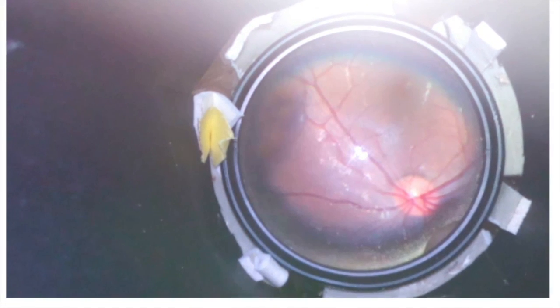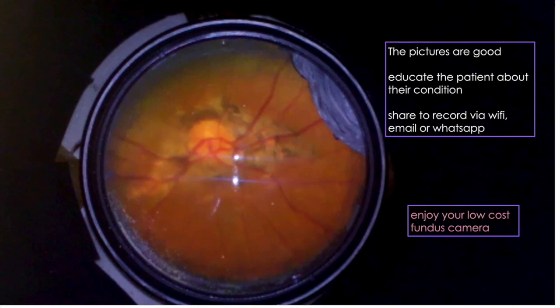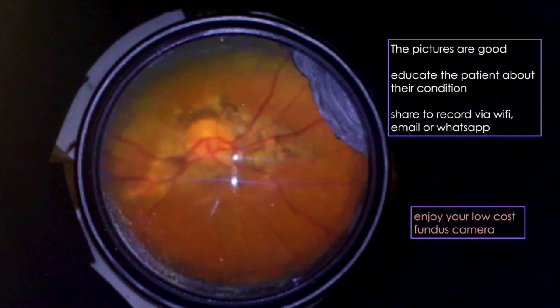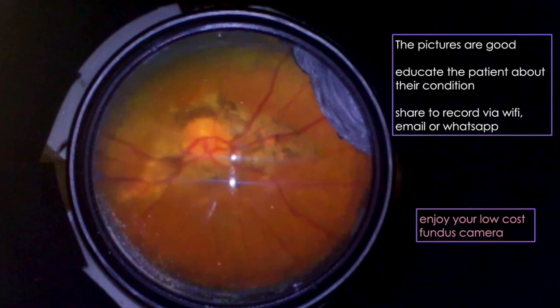The device is used like any other indirect ophthalmoscope. The quality of the pictures are reasonably good; you can educate the patients about their condition and if necessary share the image by WhatsApp, by email, or over Wi-Fi. Please enjoy your low-cost fundus camera.